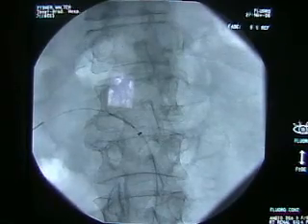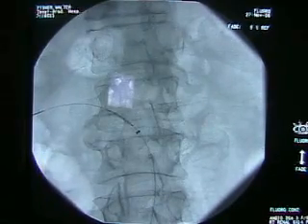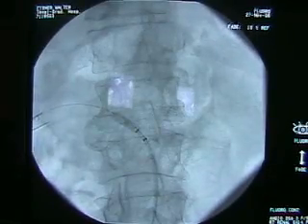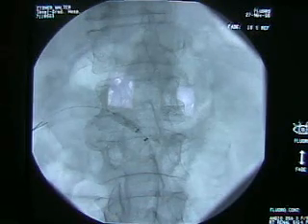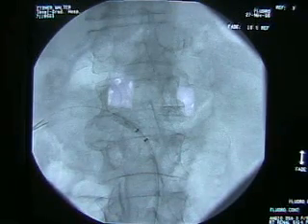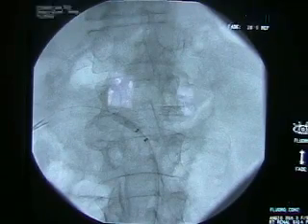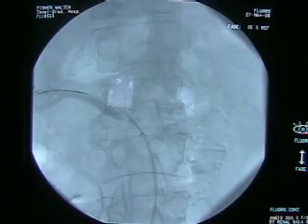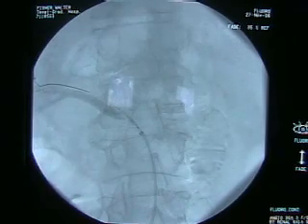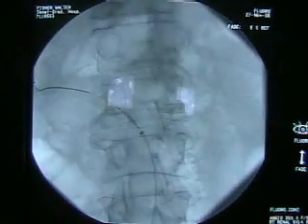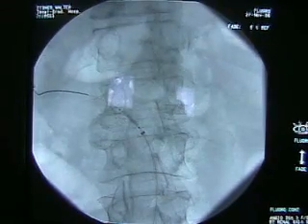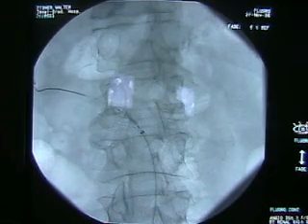The stent is then inflated with a balloon. We can see the balloon dilating the blood vessel. We identified a second area of narrowing and in similar fashion treated this area with a balloon — that is angioplasty — and stent. One can see the markings of the balloon and the stent. Here the stent is dilated to treat the narrowing.